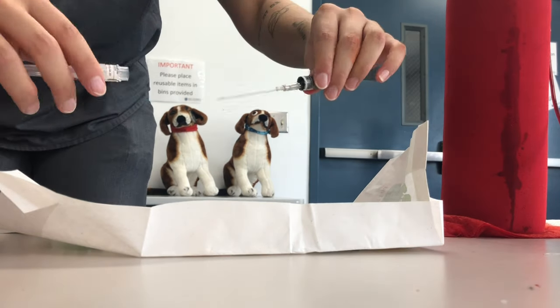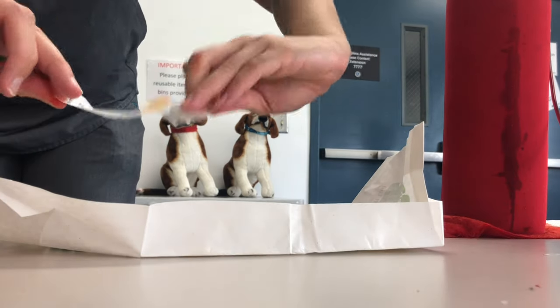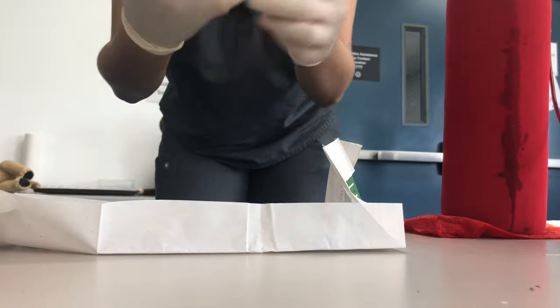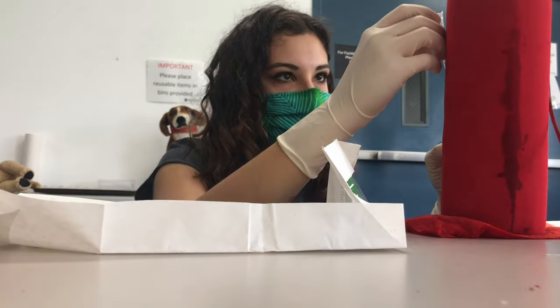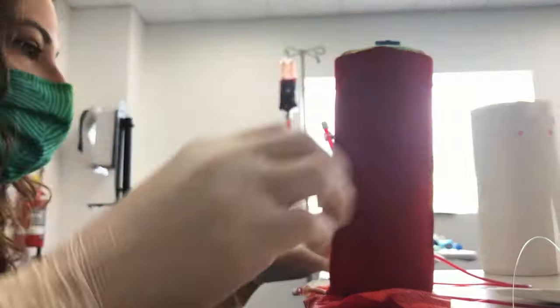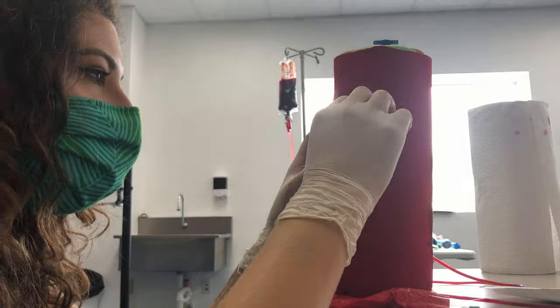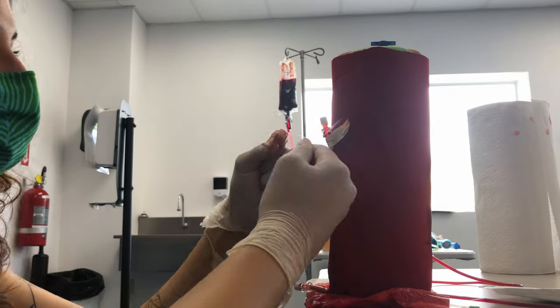I've moved over to the clinical skills lab, where I've already opened my sterile glove package and I'm using that as my sterile field to drop all of my supplies into. I've placed in a catheter, a catheter cap, a needle, and a piece of suture so I can tie in that catheter. I then sterile glove up and proceed to place the catheter. On sheep, the catheter we place for general IV access is a jugular catheter, and because it's a central catheter this has to be done as a sterile procedure. The needle with the catheter goes into the jugular vein on the neck, then I push the catheter off of the stylet of the needle, and use surgical hand ties to sew that catheter in place to the skin on the neck for consistent IV access.